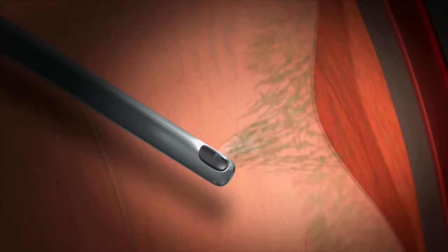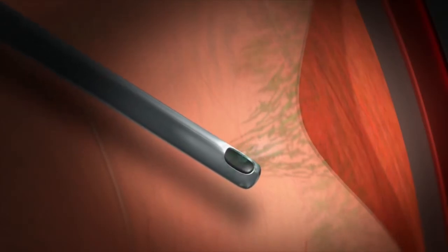After finishing the central vitrectomy and the mid-periphery, you want to cut adherent vitreous flush with a detached retina. So you are in the BSS and you want to engage the vitreous traction in the port to cut it at 1/10 of a millimeter or 2/10 of a millimeter from the retina. To do so, you must generate an aspiration flow of BSS whose force of attraction will be just higher than the return force of vitreous traction.